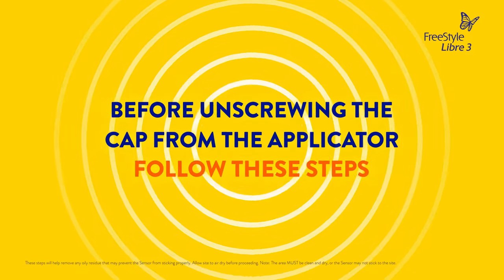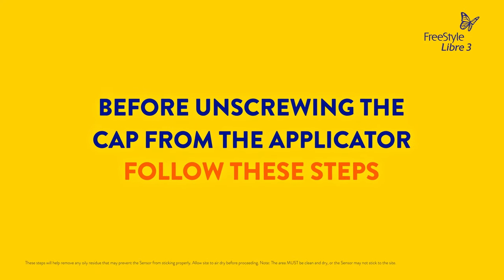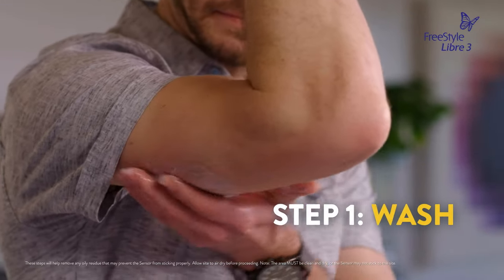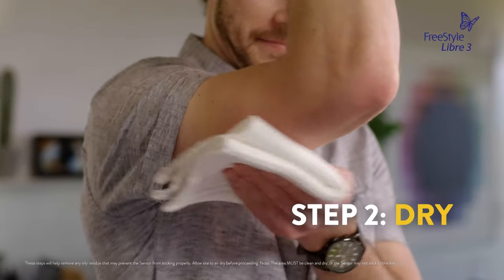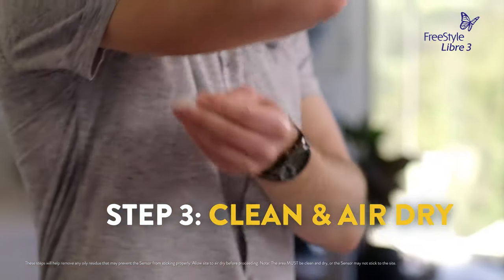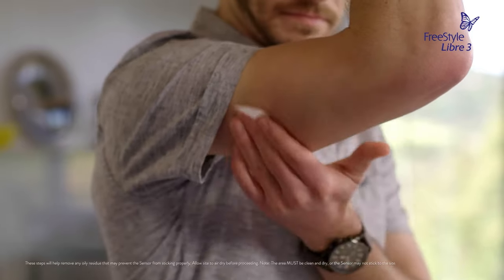Before unscrewing the cap from the sensor applicator, follow these steps to prepare the back of the upper arm. Wash the application site with plain soap and water. Wipe dry with a clean towel. Clean with an alcohol wipe and let air dry. Following these three easy steps helps ensure the sensor stays on your skin.